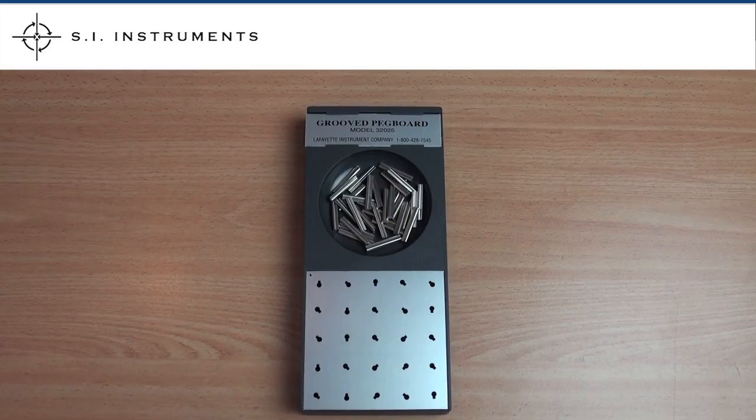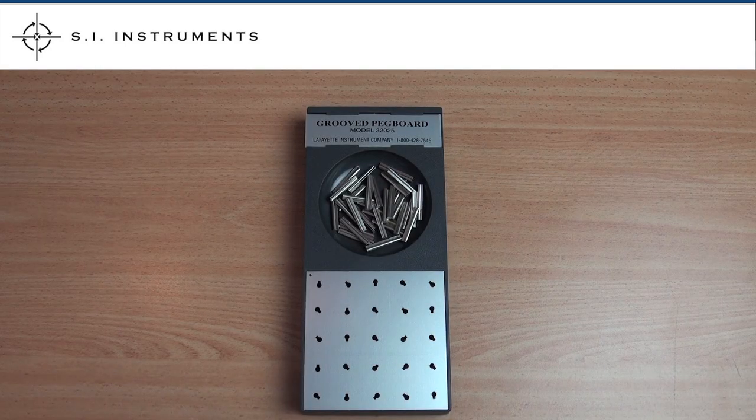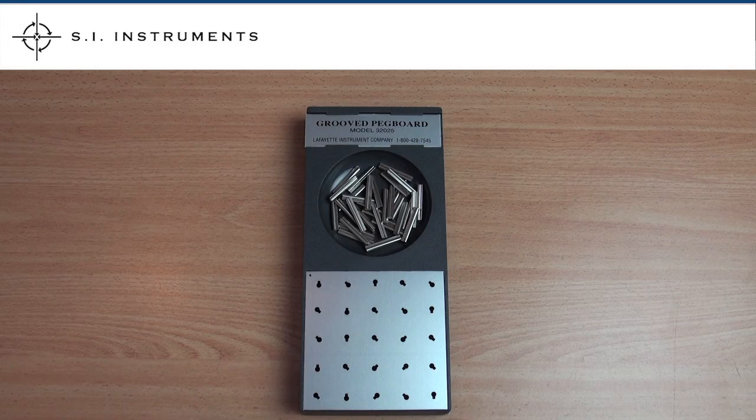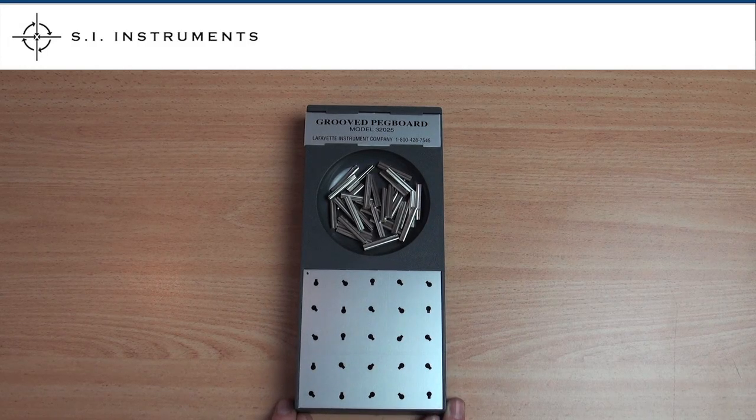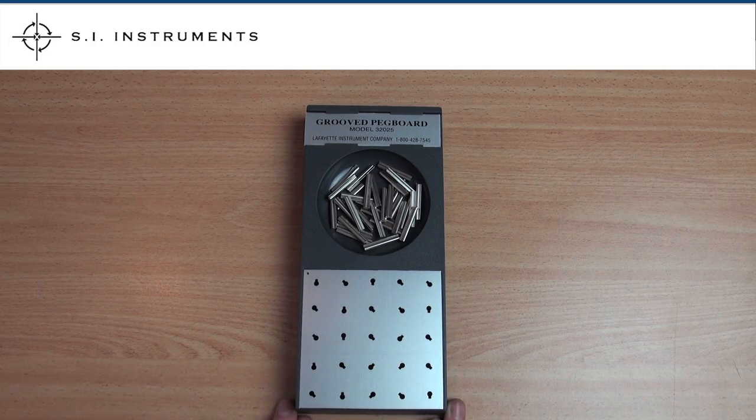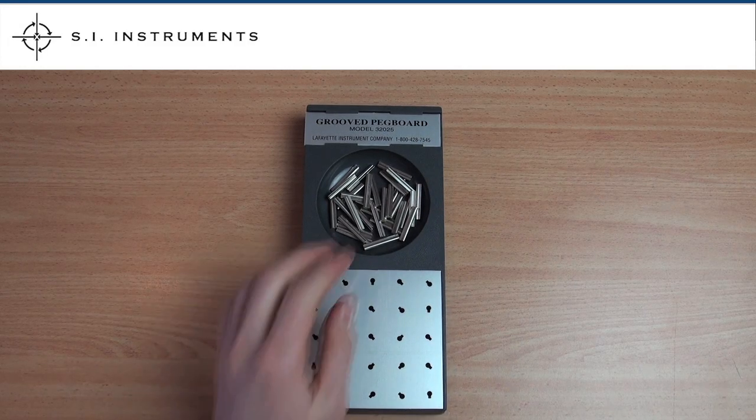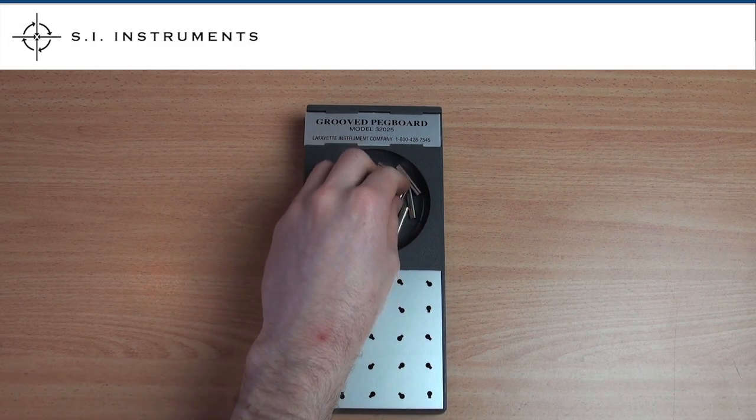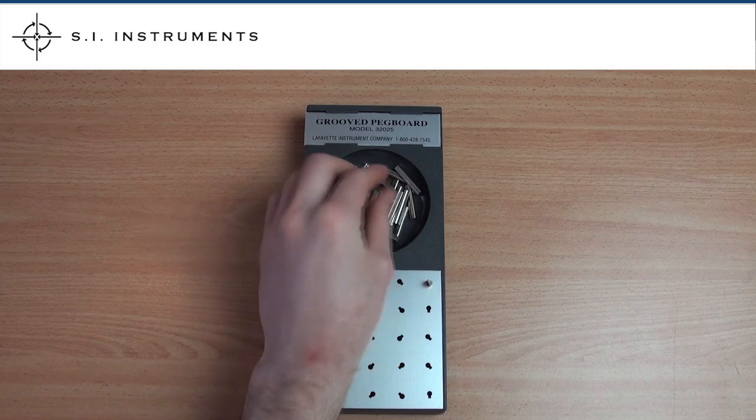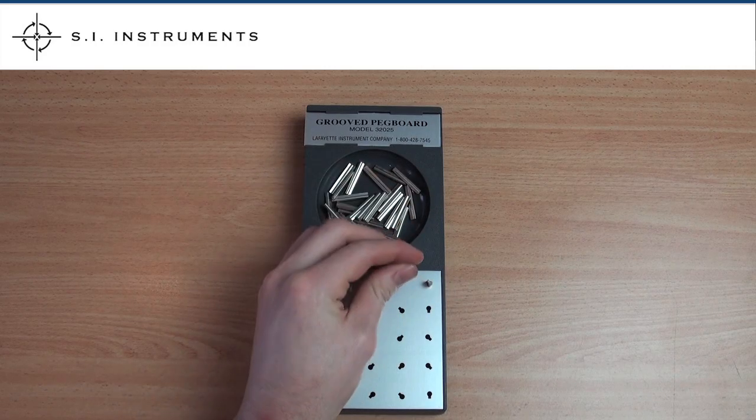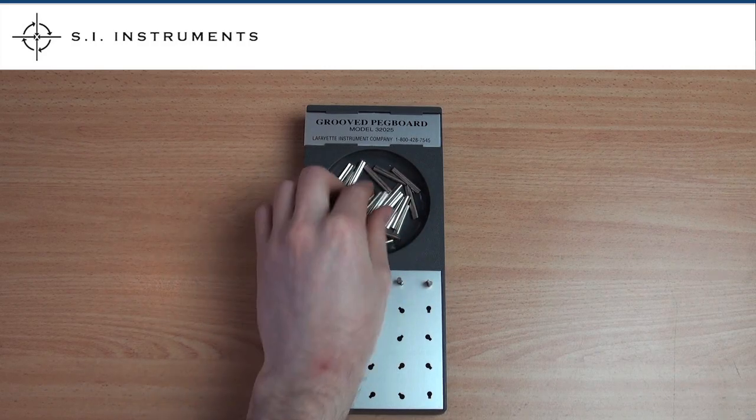To begin this test, place the pegboard directly in front of the subject so that the board is at the edge of the table. Before beginning the test, the examiner explains the test to the subject using the instructions in the manual provided.